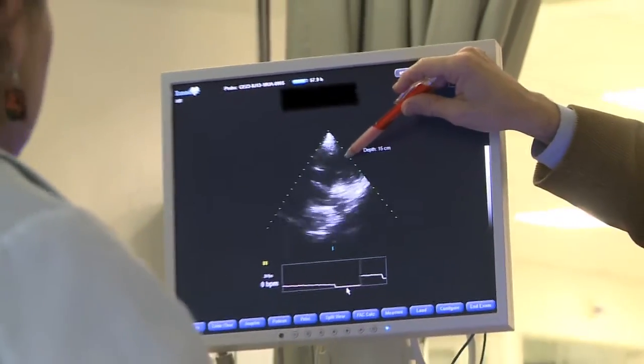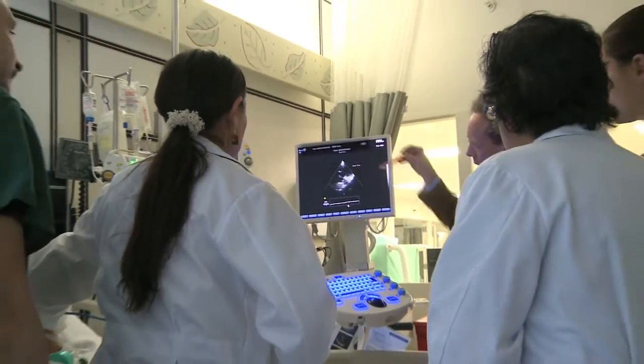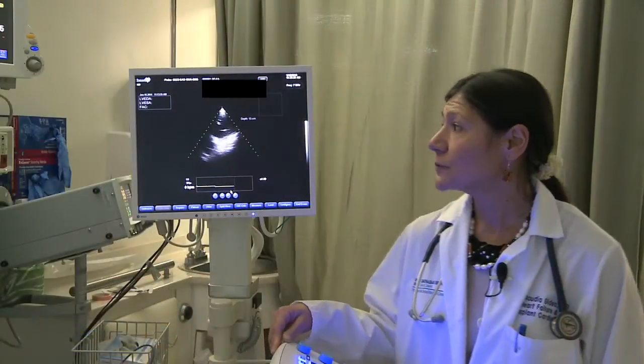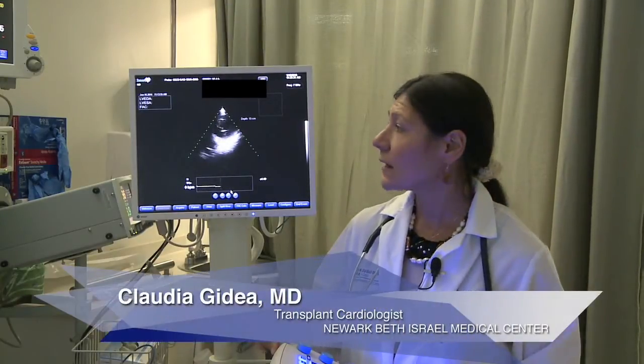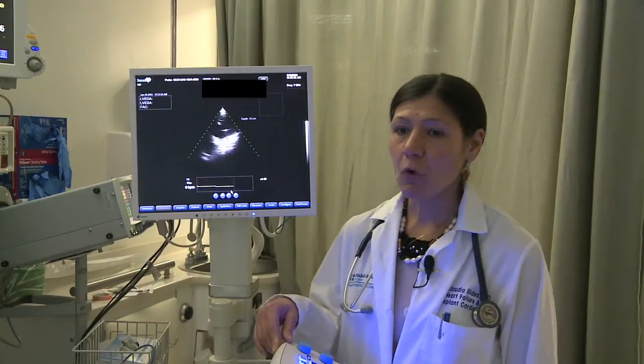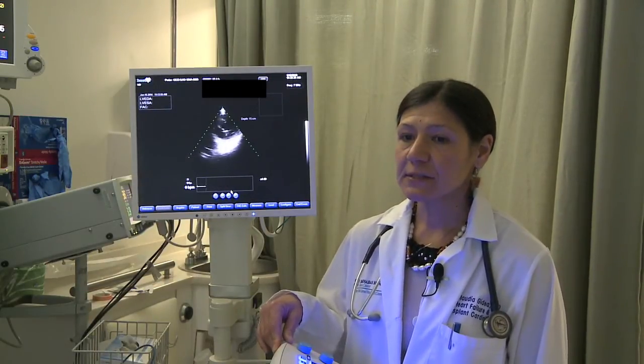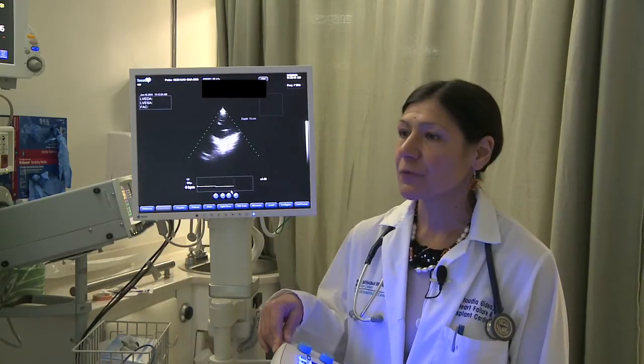The post-operative care of a heart transplant or an LVAD patient is quite difficult. Oftentimes they're hemodynamically unstable, and we watch the pressures on the standard monitor at the bedside. But what we really can't see is cardiac function directly — at least until now. Patient BM, post-operative day one after LVAD exchange: the setup speed from OR is 8600 RPM, the PI is 6.2, and the pump flow is 5.3.